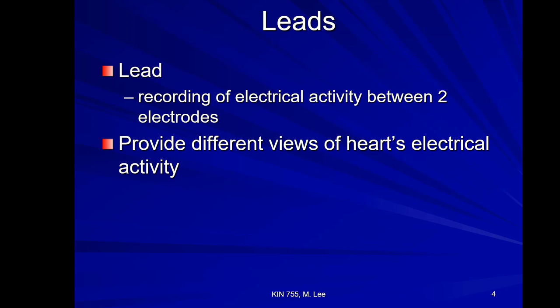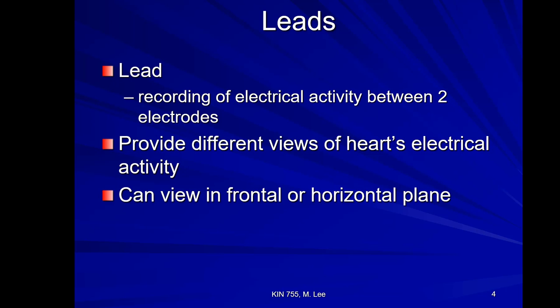And in an EKG, each lead gives us a slightly different view of the heart. So you can think of the leads as kind of like different cameras giving you different views of what's going on in the heart, at least electrically. And most commonly in clinical situations, a 12 lead EKG is utilized. So you're actually getting 12 different views of the heart.